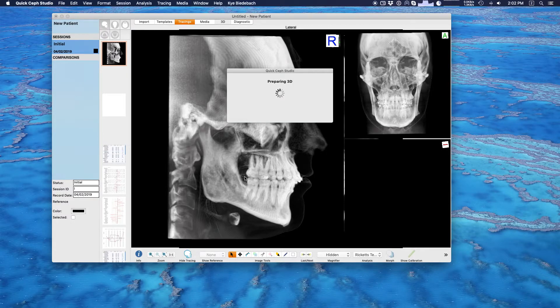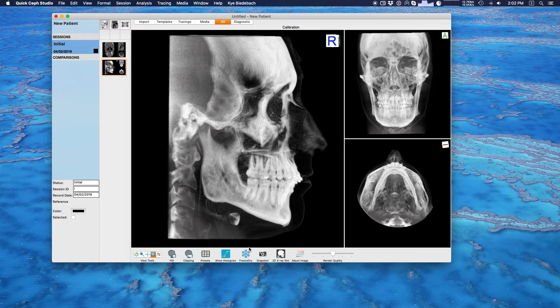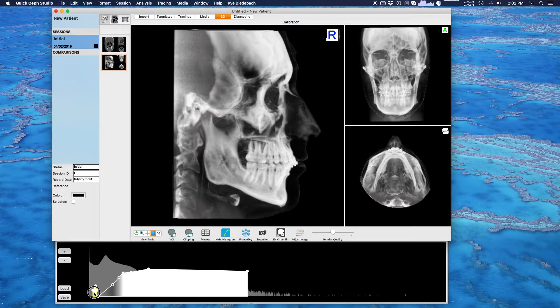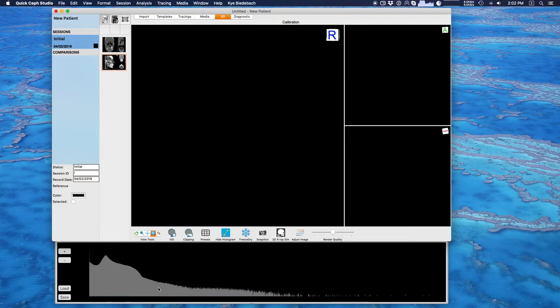Down here we have the show histogram button, which is actually a representation of your data. I'm going to delete them both to begin with and explain this. This mountain shape represents your DICOM data. Going from left to right is the density — really light dense tissue on the left, and as we go to the right it's heavier dense tissue until it hits bone, teeth, metal if they have braces, all the way to the right.